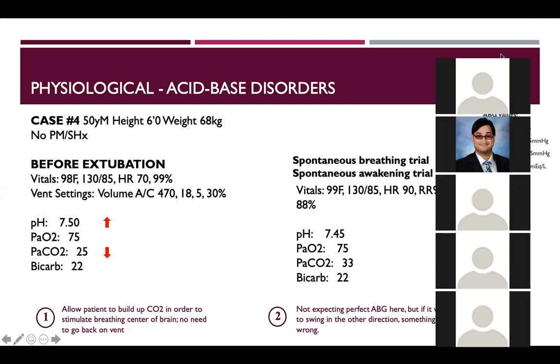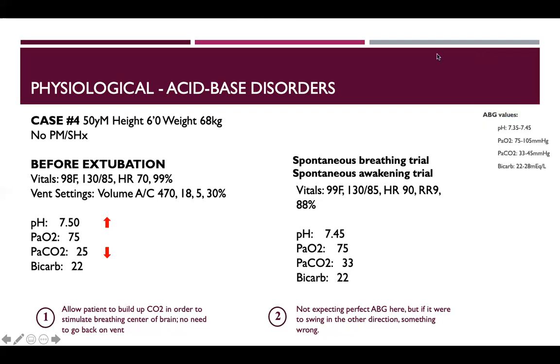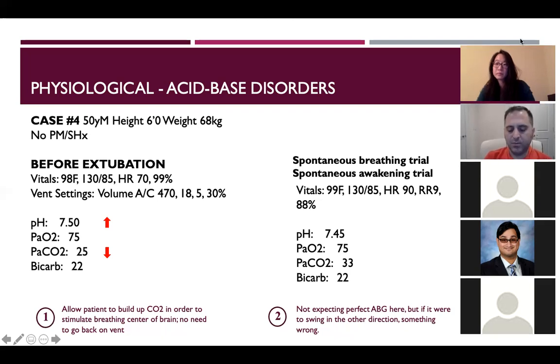Yeah, the package of SAT and SBT is to pause the sedation, let the patient wake up, and then do the SBT. Sometimes the nurses would do the SAT and pause it and then simultaneously go on to the spontaneous breathing trial, thinking that the patient will wake up. And if you have taken over all the work of breathing, then the patient would not work.